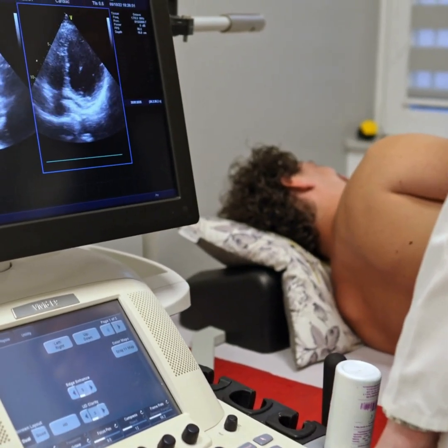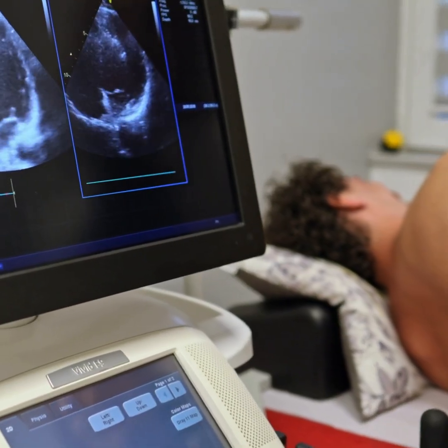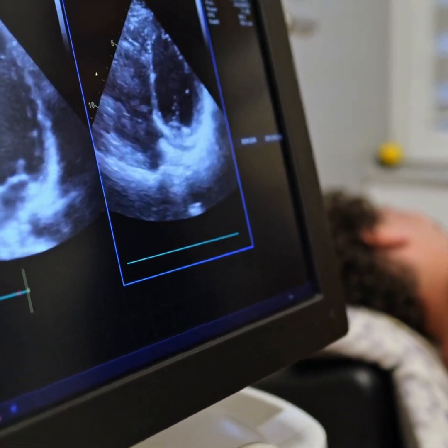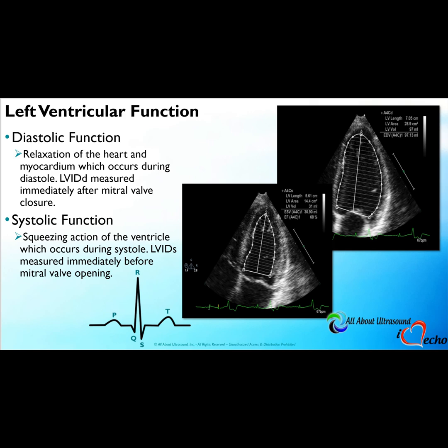On echocardiography, evaluating for diastolic function, we also must assess for systolic function. The diastolic function is the relaxation of the heart and the myocardium, which occurs during diastole. We measure the left ventricular internal dimension in diastole immediately after the mitral valve closure. End-diastole is defined as the onset of the QRS.